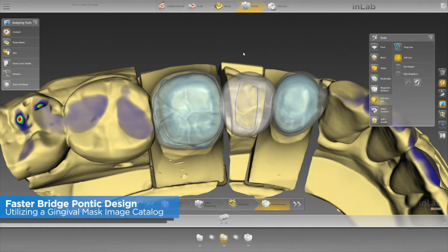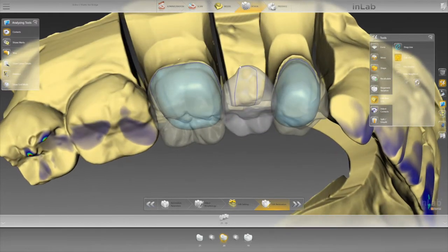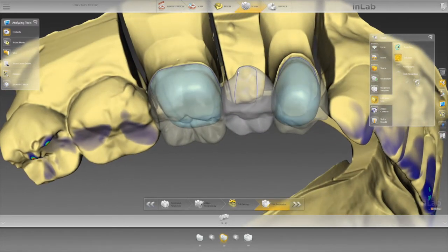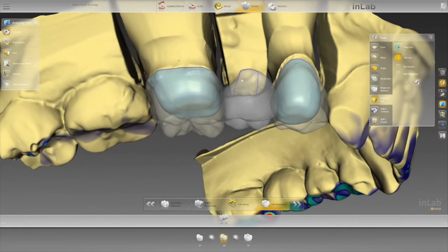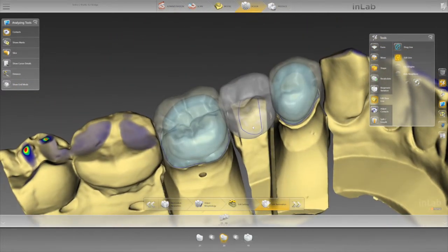So if you want to edit your baseline, many of us will actually trim a model, trim our dies so we can identify the margins very well. We want this thing to fit really good, but we have to sacrifice the pontic area where we cut it out. In doing so, it's impossible to design anything underneath that, so we need to have a solution.